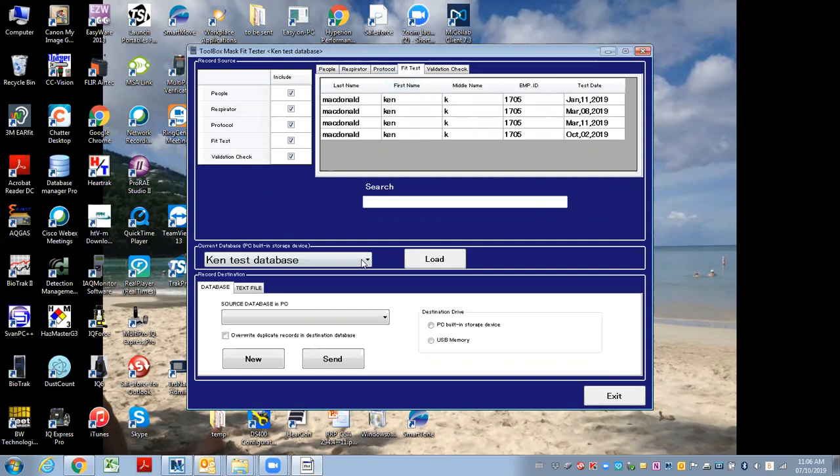I can also choose to load a different database if I want to. But this portion down here is where you can export data or import data.